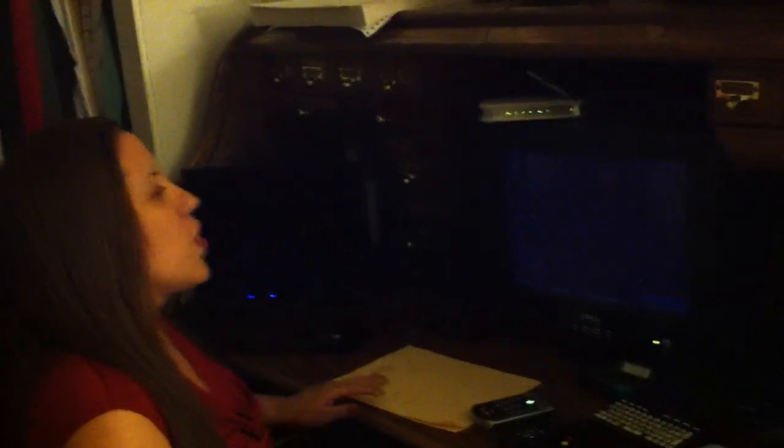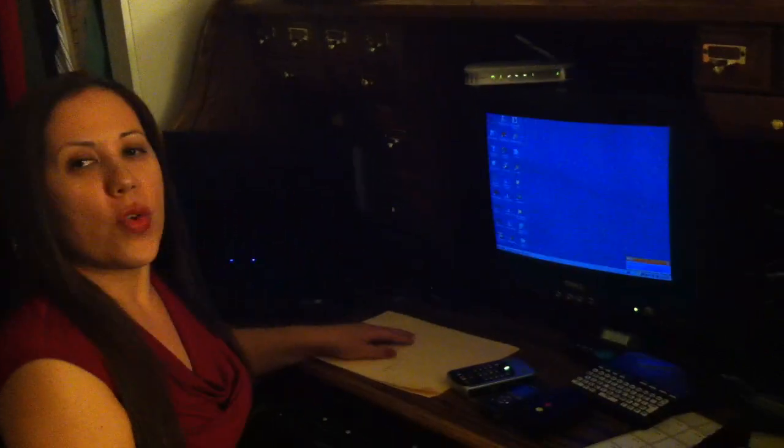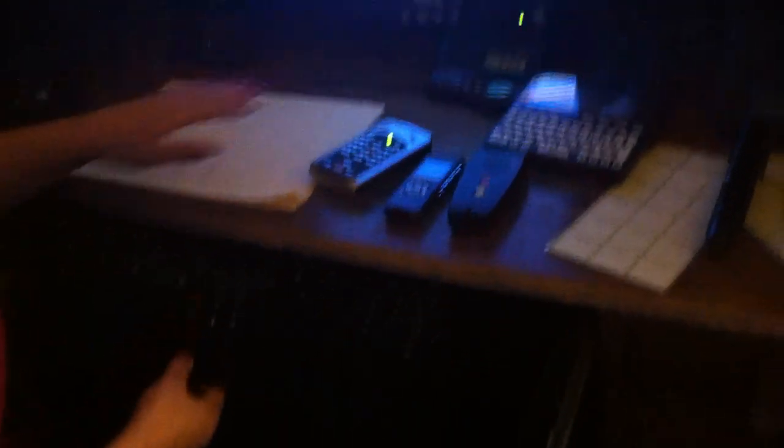Okay, so the computer - the blind, we do not use the mouse because we're not able to see and click on whatever we're doing in the computer. We use a combination of hotkeys.